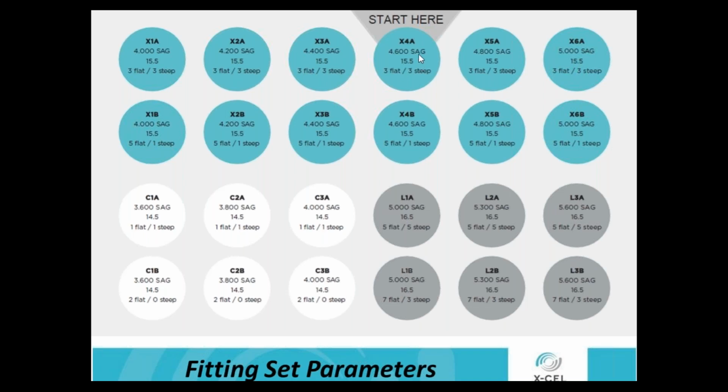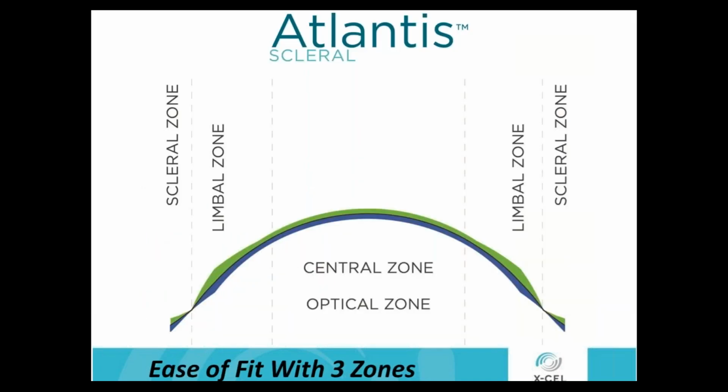So again, you'll see what's labeled on the vial, and we're going to go through each of these to tell you what you're seeing and then what we're looking for. With our design and most designs, we fit from the inside out. We want to fit that central area first, and then the limbal area, and then the scleral zone. And there's a reason for that.